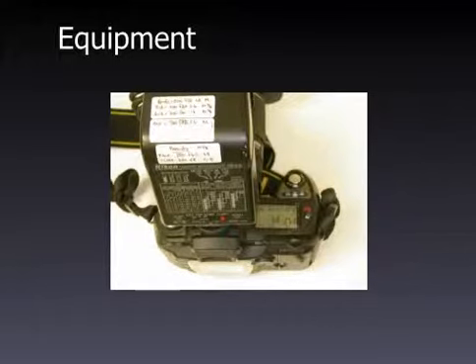And the flash settings: this is a manual flash, so we've placed some adhesive labels onto the flash so that we know the close-up work aperture is f22 because we want depth of field. Shutter is 1/500th and the flash is on quarter power.